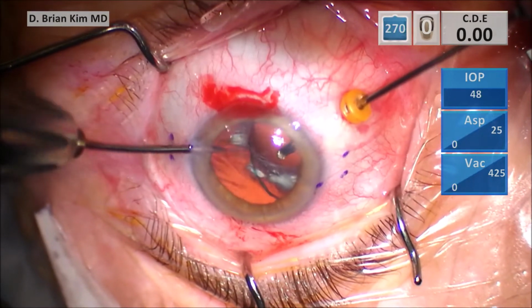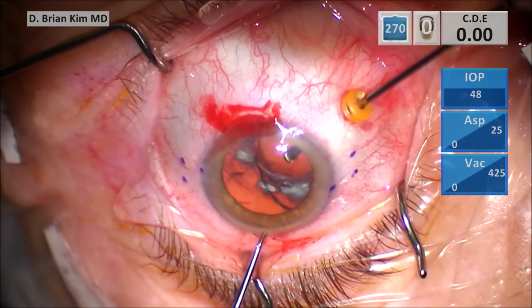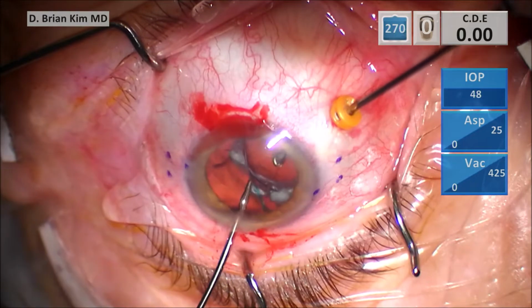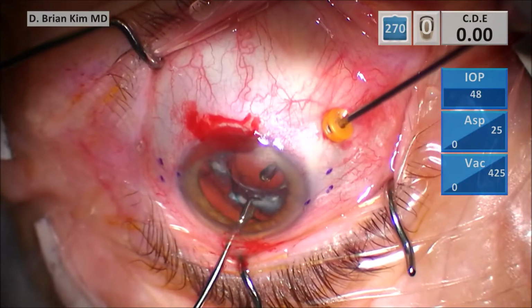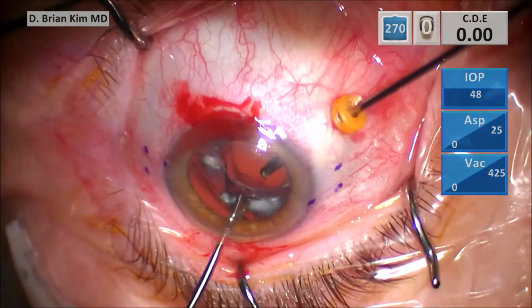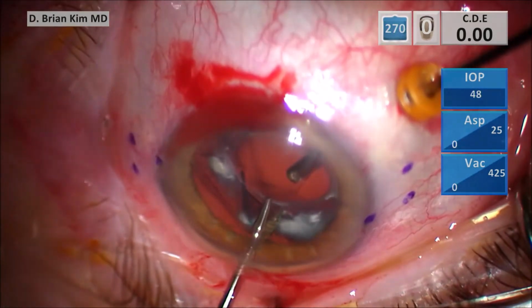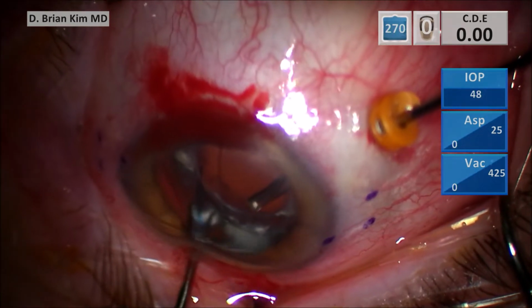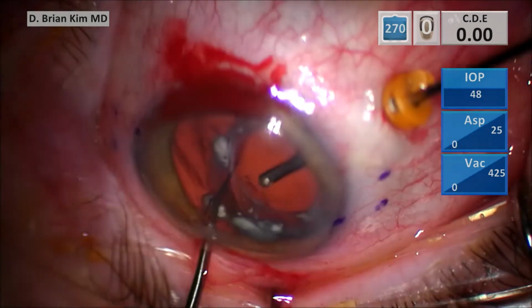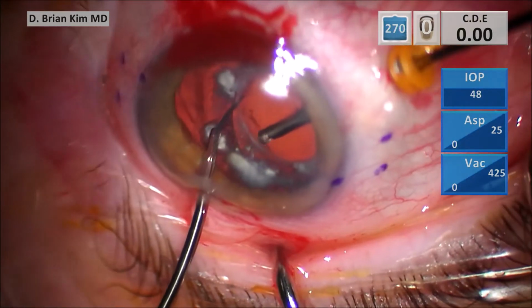I have micro graspers on the other side, on the left side. First, I tried through the para, and I was like, let me try to go through the main incision since the haptic is presenting itself closer towards the main incision. So I'm lifting with the vitrector, lifting the lens up. I'm tilting the vitrector through the trocar up. You can see the eye is turned down towards me, partly because, remember, that vitrector is straight and that nose is in the way. I've grabbed the haptic.